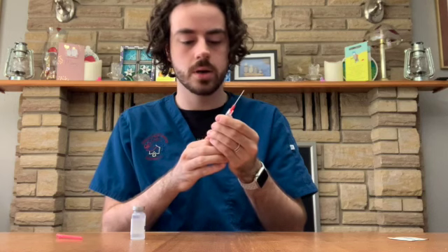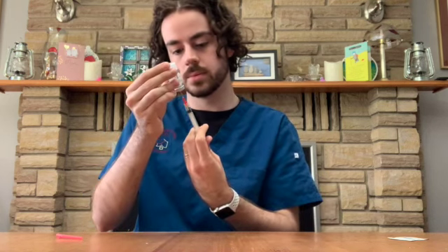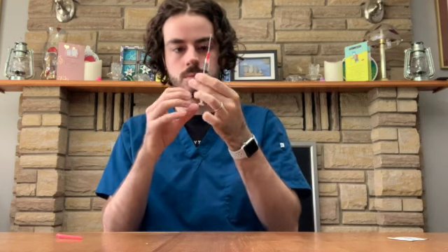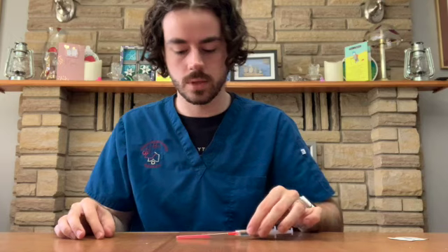I'm going to pull back to the amount of medication that I'm looking for, which is 1 milliliter. So I'm going to inject 1 milliliter of air. And then I can get to drawing up my medication, making sure not to get any air bubbles in. Perfect. And I'm just lining up the bottom of the rubber stopper to the line that I'm looking for. So the 1 milliliter line.